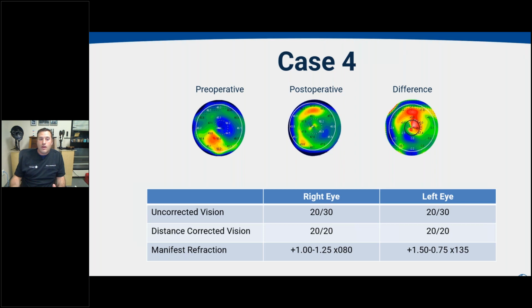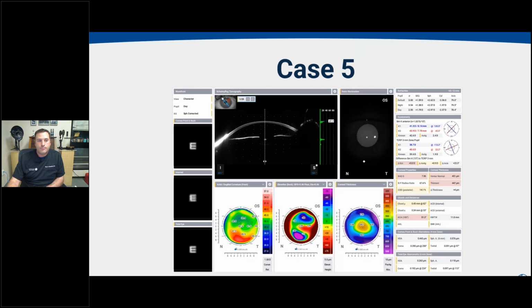And in fact, if we had done cataract surgery for this patient first, we really would have been in a much worse situation, because clearly our ability to predict the refractions for a patient like this decreases. We might have thought to put a toric lens in a patient with astigmatism, which would have probably turned out to not work particularly well with the irregularity. And then we'd have to deal with that sort of an exchange. And no matter what, at the end of the day, we're going to have to deal with the cornea at some point to give this patient adequate vision. And we were able to do that beforehand and really address this patient's true visual problems.